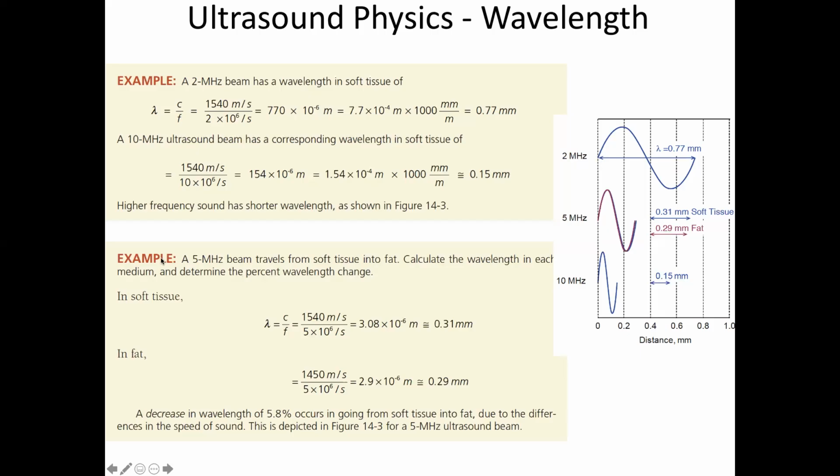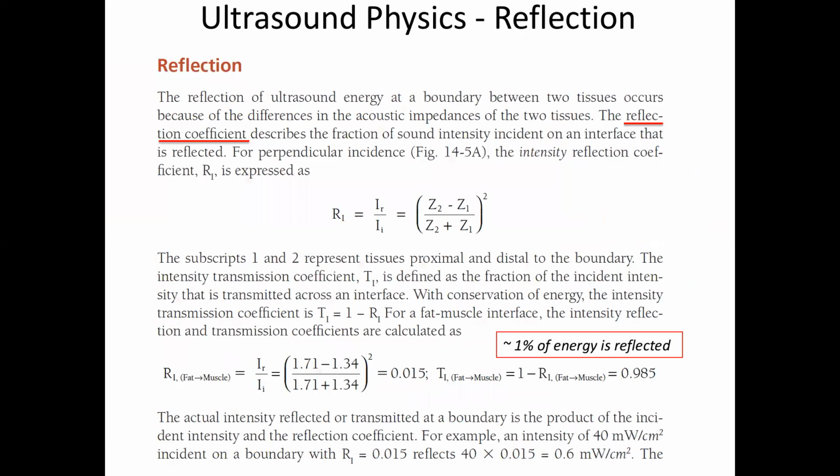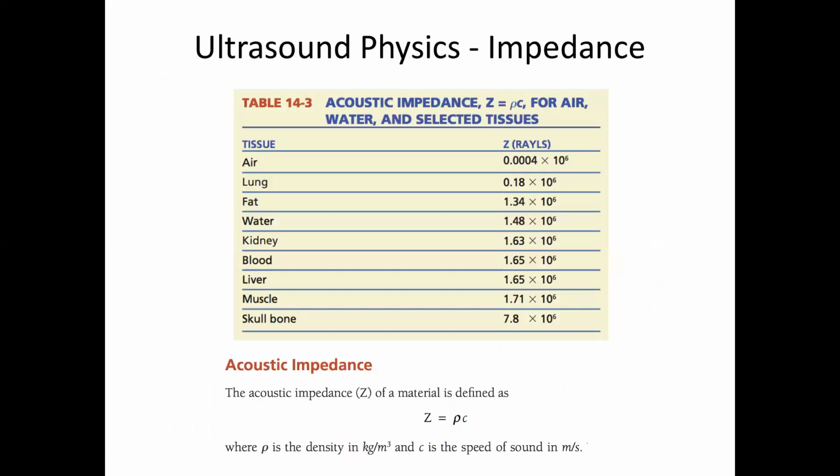Well, we wanted an introduction to acoustic impedance in terms of reflection. Okay, here we go. We're going to ask the question. The way ultrasound imaging works is you send out a sound wave like a chirp, and it's very short.